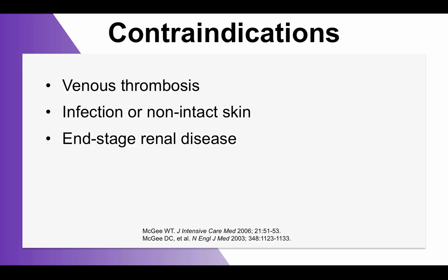In a patient with end-stage renal disease or in a patient that is going to be on dialysis in the future, avoid the subclavian vein due to the fact that these patients tend to get stenosis of this site. Additionally, it is a good idea to avoid the subclavian site in patients that have been in the hospital multiple times with multiple lines because they can also get stenosis.